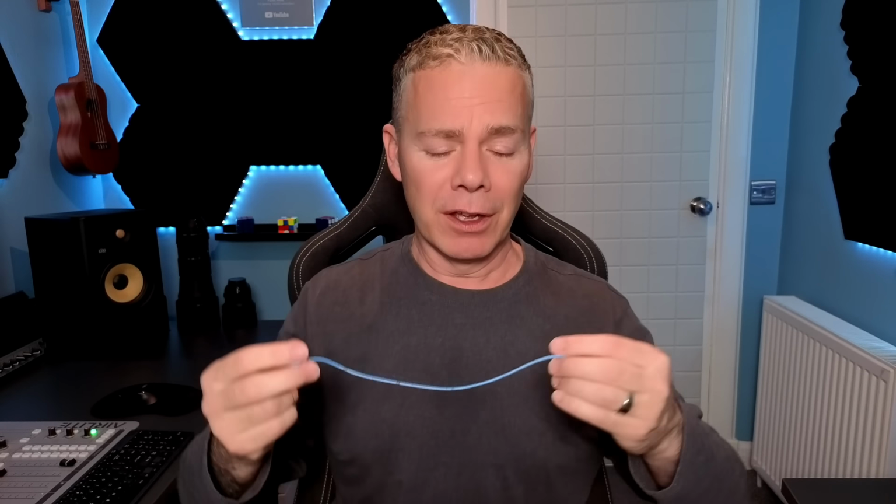Now, sometimes the surgeon will remove this stent. The last time I had it done, he did remove it. But this time, because the operation I had was in Edinburgh, which is about 5 hours away from where I live, he put the stent in and gave me instructions on how to remove it myself at home.